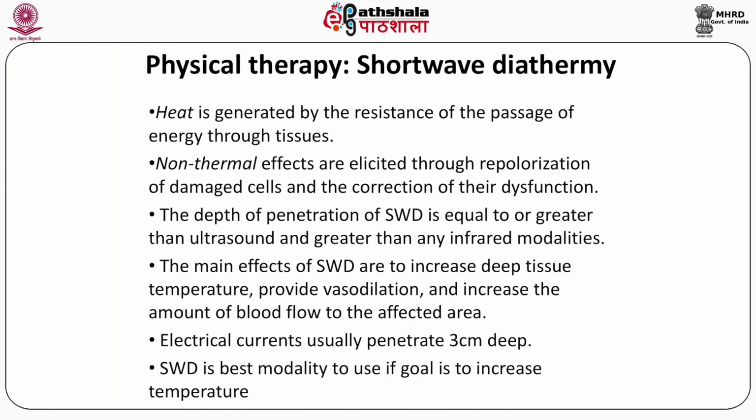Continuing with the physical therapy, in the shortwave diathermy method, the shortwave travels through the tissue generating heat. The heat is generated by the resistance to the passage of the energy through tissues. The non-thermal effects are elicited through repolarization of damaged cells and the correction of their dysfunction. The depth of penetration of shortwave diathermy is equal to or greater than ultrasound and greater than any infrared modalities. So this penetrating power of shortwave diathermy is used for the purpose of physical therapy.